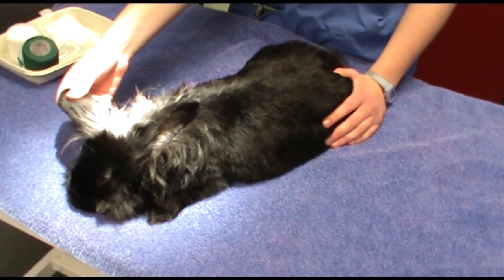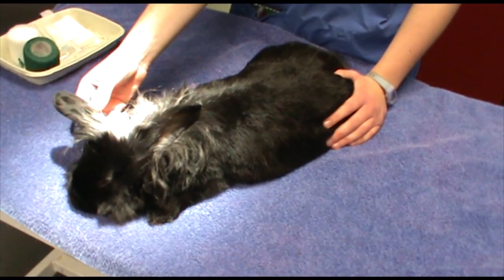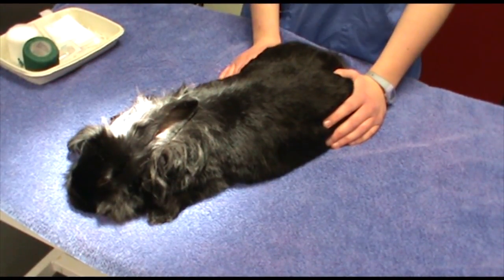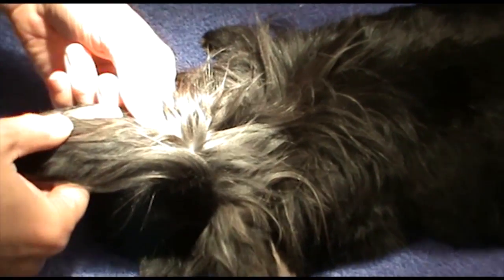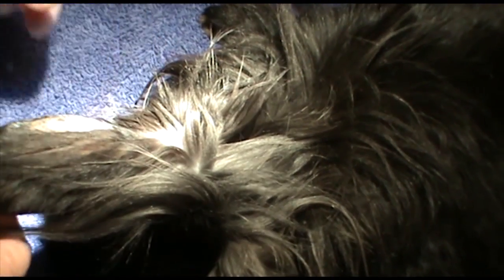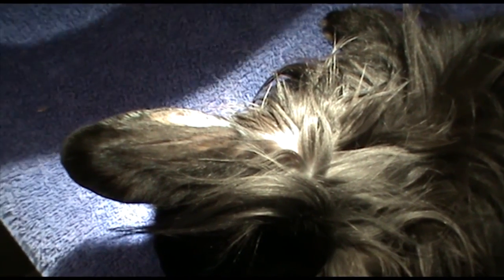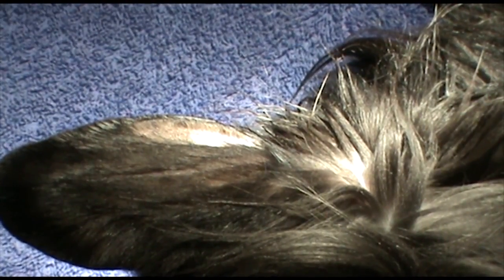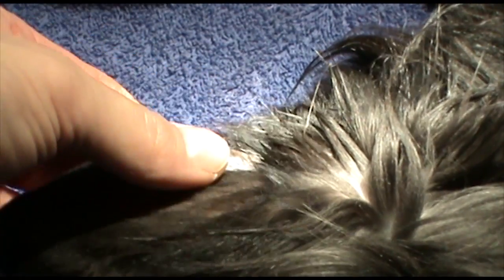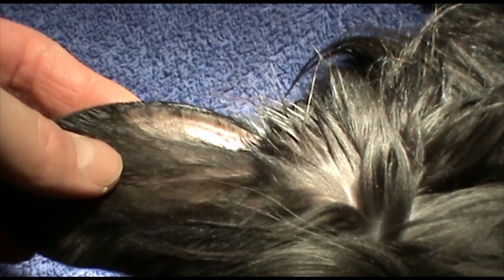We're going to the marginal ear vein. We catheterise pretty much all the rabbits for procedures and interventions like this — from a fluid therapy point of view and a safety point of view. We've got an access point for reversal agents and things like that that we can give fairly instantly, so having an IV line there makes everything a little bit on the safer side.